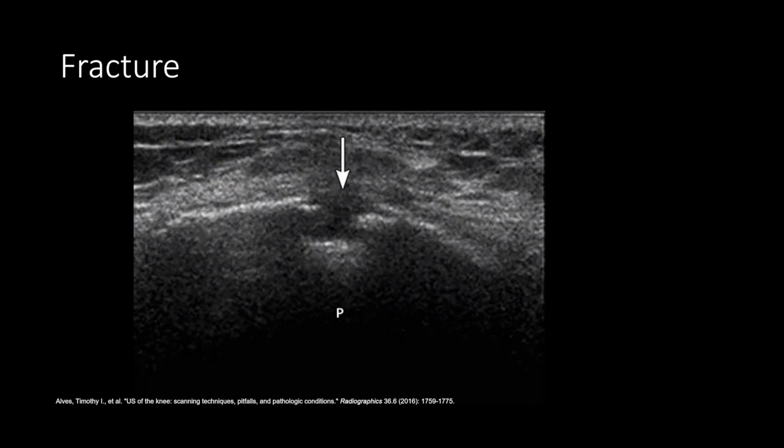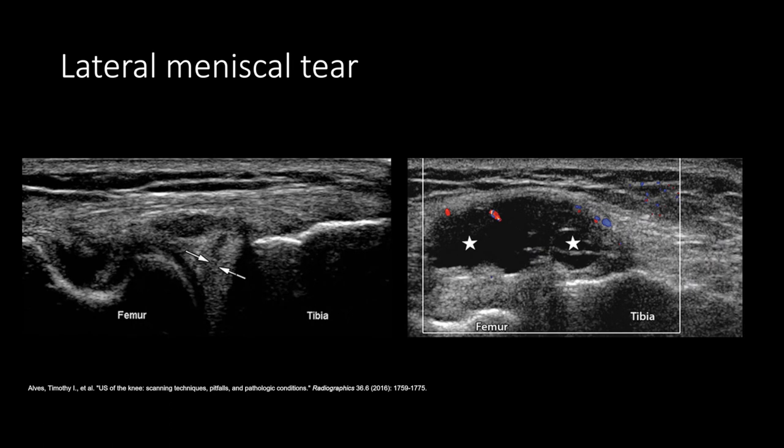This is a patellar fracture. The longitudinal ultrasound image shows the anterior patella with a focal cortical defect. Ultrasound isn't usually great for looking at the menisci, but here you can see on the left image a linear hypoechoic defect at the lateral meniscus consistent with a tear. The right image is a more posterior view with color Doppler, and you can see an associated parameniscal cyst.